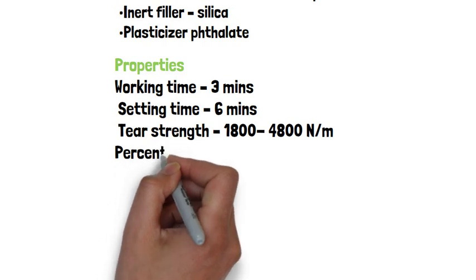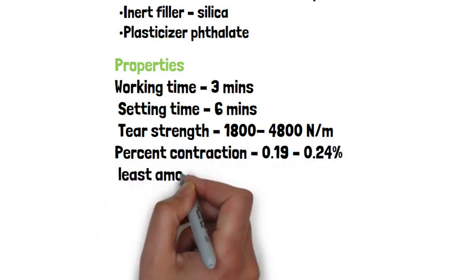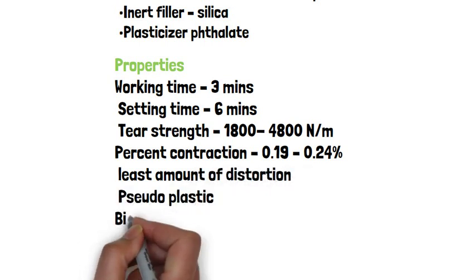Percent contraction 0.19 to 0.24%. Least amount of distortion. Pseudoplastic. Biocompatibility: contact dermatitis.